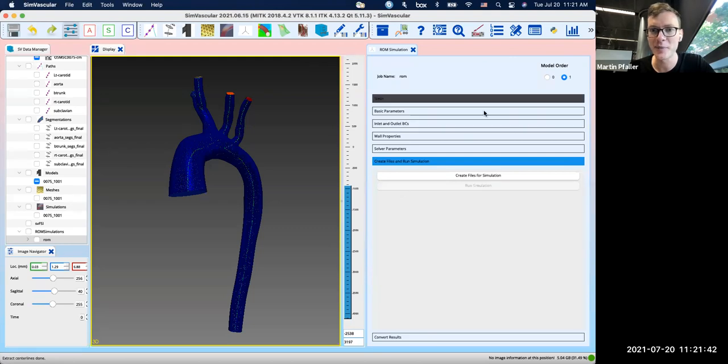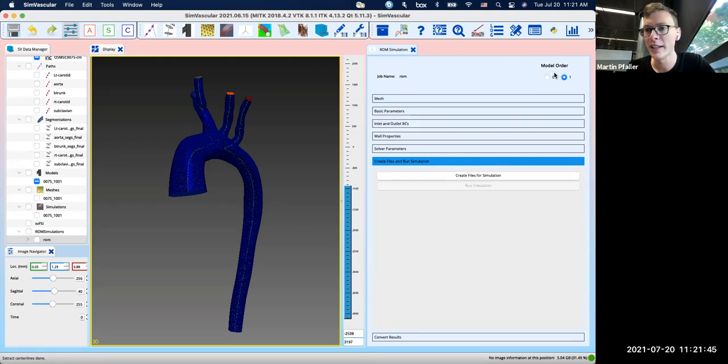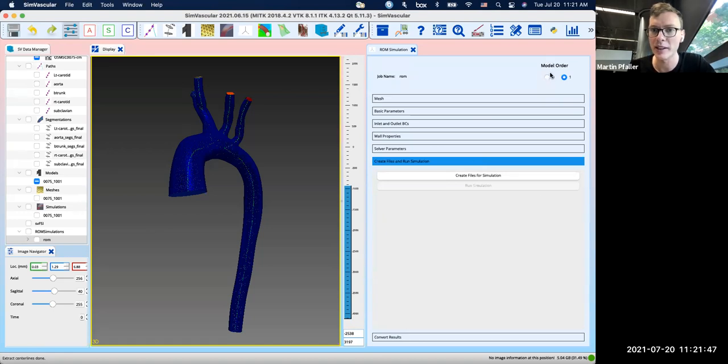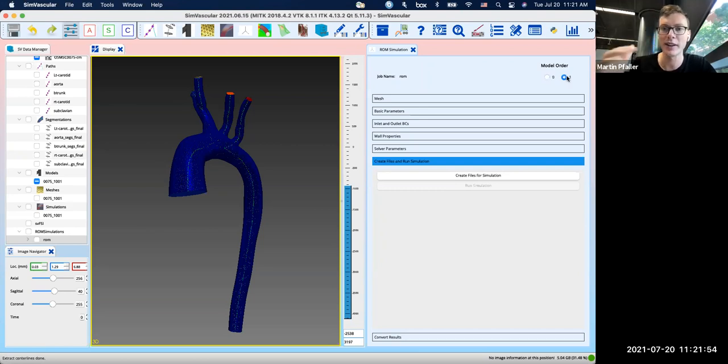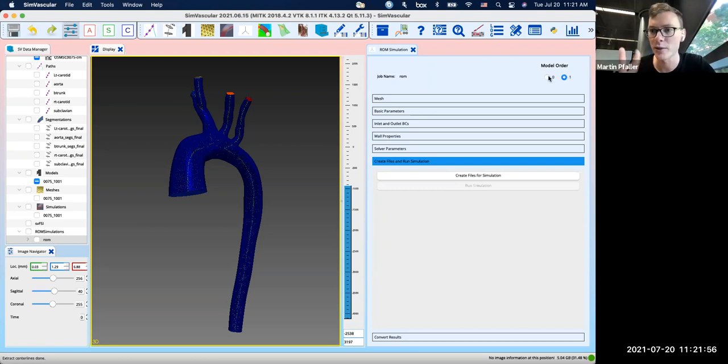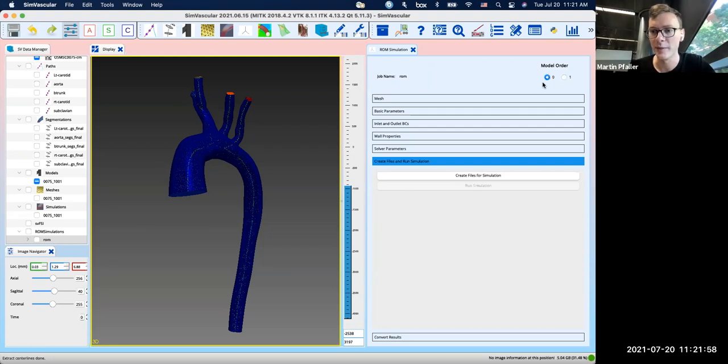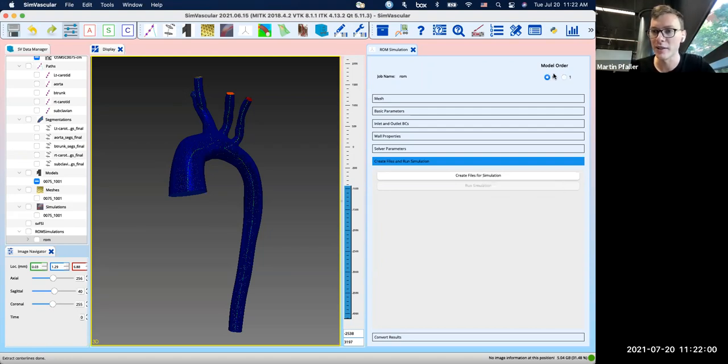And then you can actually already go ahead and run a simulation. So for this whole plugin, you have a choice in the top right corner to choose between 1D or 0D simulations. So everything works the same. You can just switch the model order. And so now we're going to leave it at 0D.